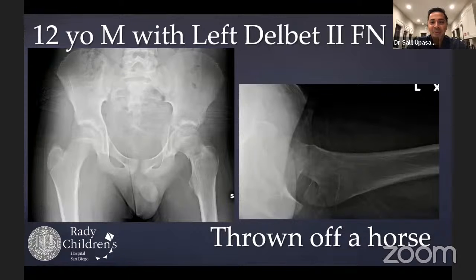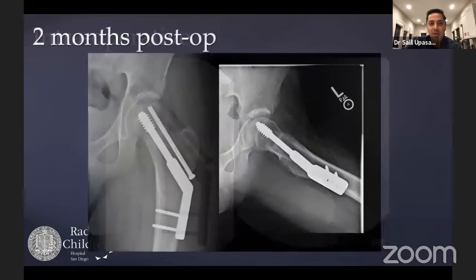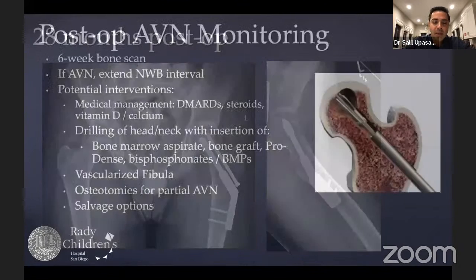This is a 12-year-old with a left type 2 femoral neck fracture after being thrown from a horse, who underwent open reduction. I prefer the Watson-Jones approach. I feel like it gives a good exposure, but I agree the Smith-Peterson is excellent, especially the closer you get to the physis, the better it is to get the reduction from anterior. So this was the construct that we used here. He is at 2 months post-op and 28 months post-op, healed well with no complications.